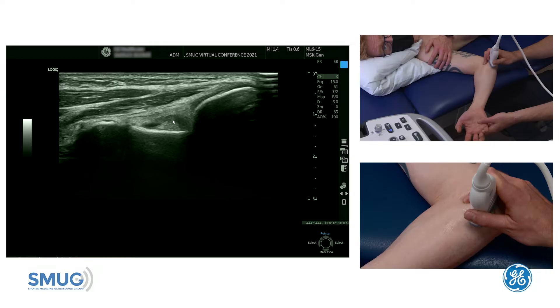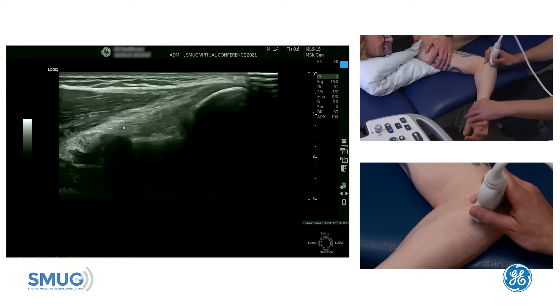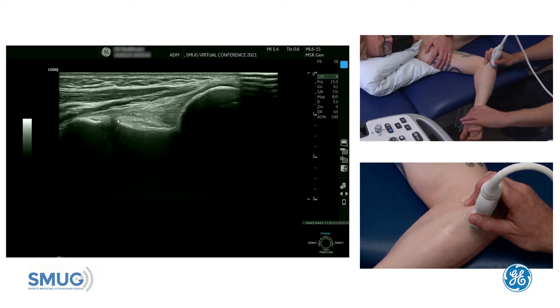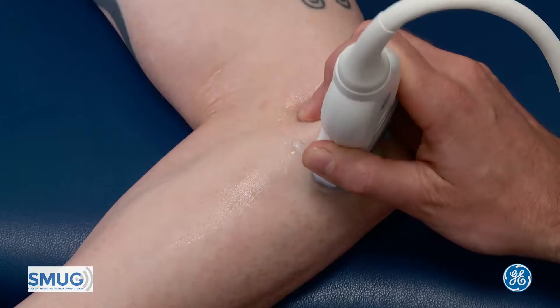It's worth scanning through to see if there's any joint fluid, which we have there, and that can track underneath the ulnar collateral ligament. This is a very nice position to carry out the stress test — all we need to do is apply a bit of valgus stress onto the joint, and you shouldn't see the joint open up, just like in this example here.